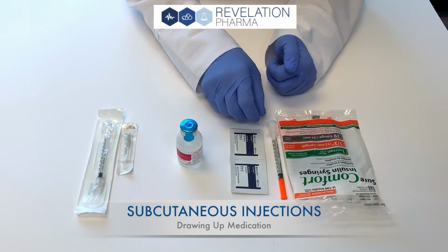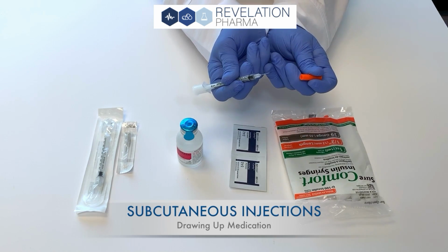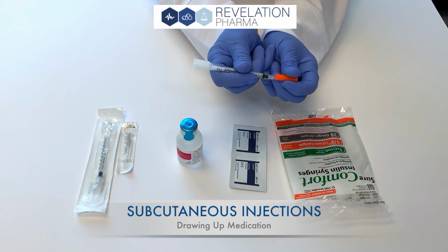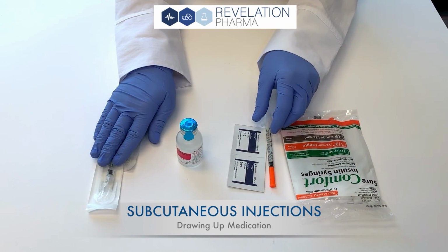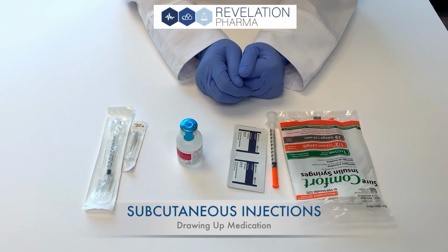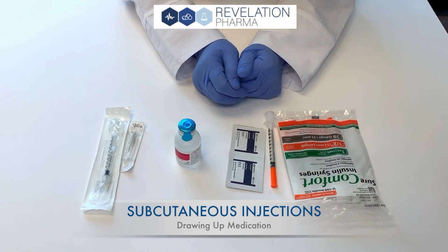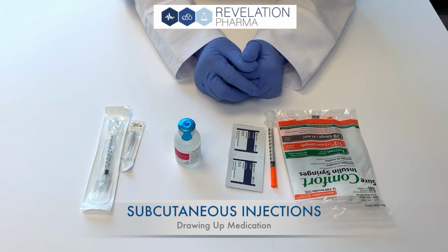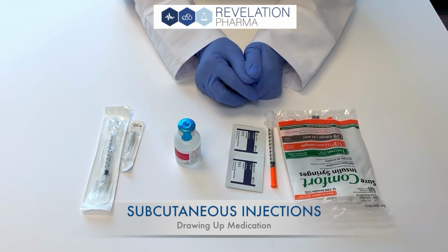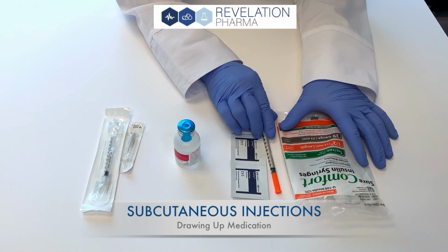Typically, the needle is 1/2 inch in length, but this can vary. Syringes also come in different sizes, so make sure you know how much medication you are to draw up with each dose. The label that has your name on it will tell you the exact amount of medication you are to draw up with each dose, how often, and where to inject it. In this video, we are going to show you the steps for a subcutaneous injection.